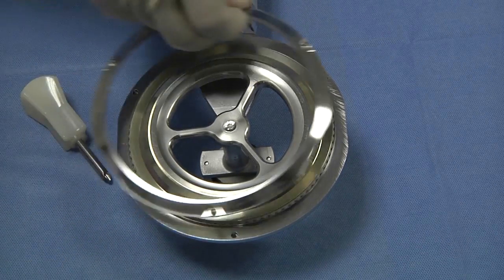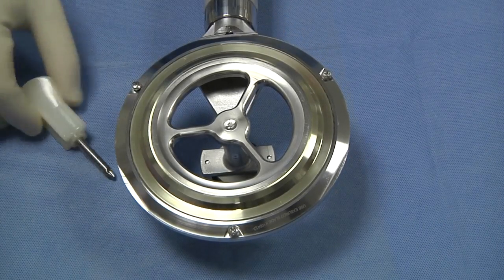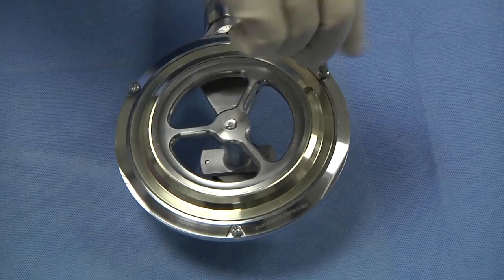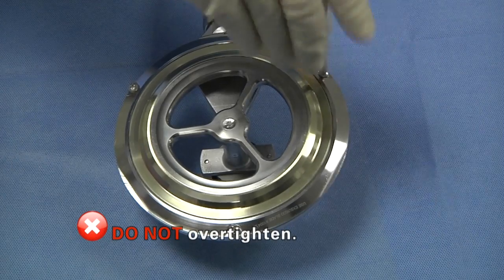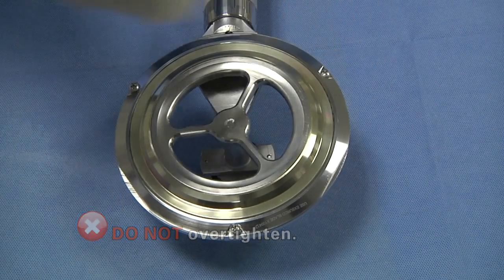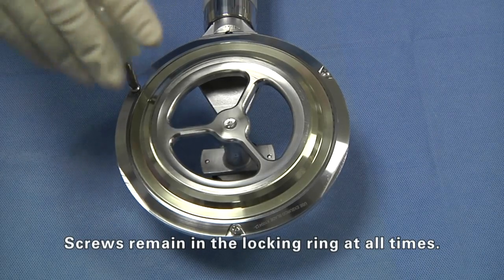Place the blade locking ring into the housing, lining up the captive screws with the screw holes on the housing. Tighten into place using the screwdriver until the screw grips and do not over-tighten. The three captive screws should remain in the blade locking ring at all times.